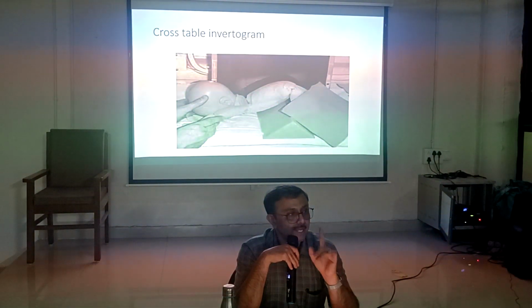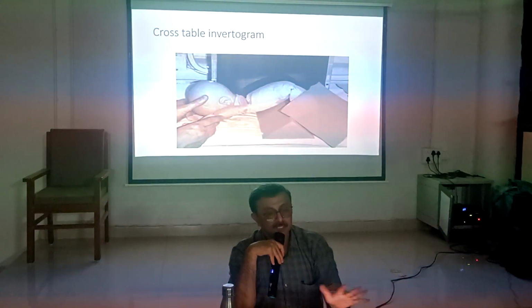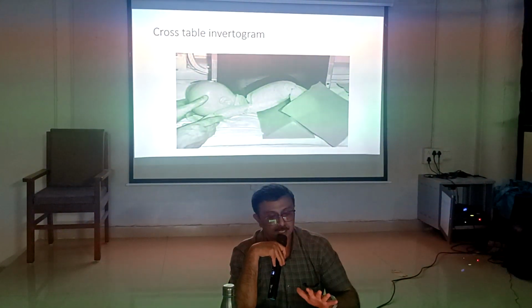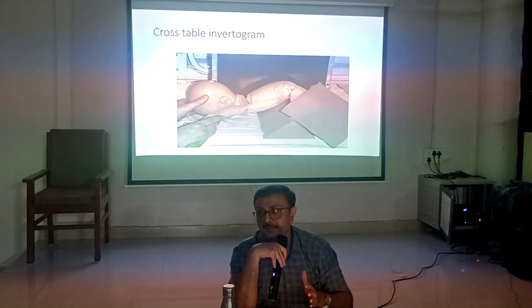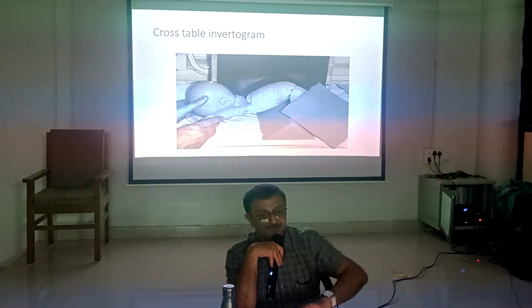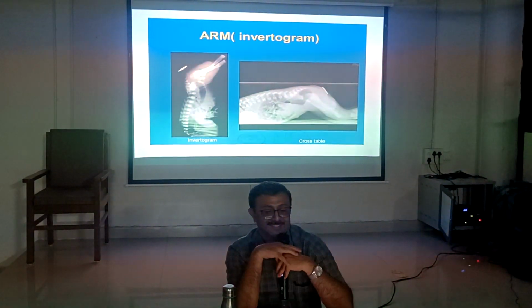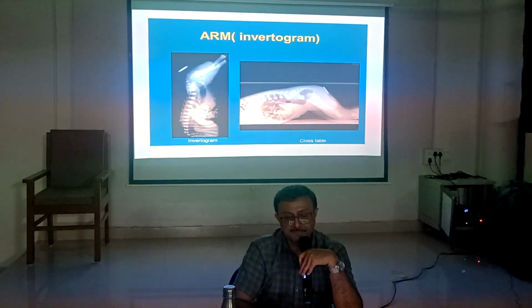So this can be identified by invertogram. This is a cross table invertogram. Now tell me which is more visible. Okay, again it is a cross table invertogram.